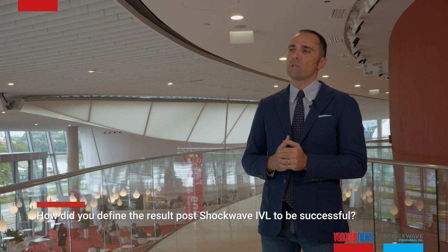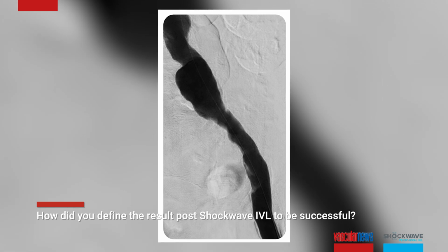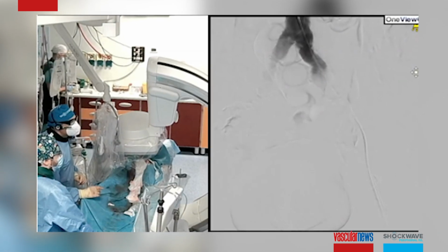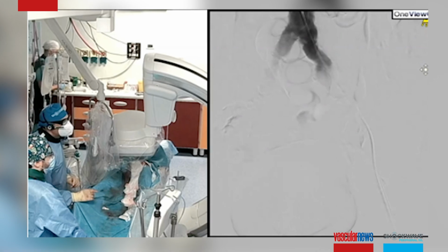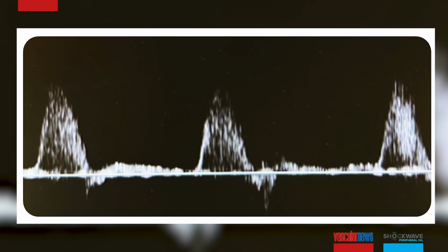Of course, as always, we do at least 2 angiograms with multiple projections, and we add the EVUS control and the pressure gradient. We had no pressure gradient at the end, and the EVUS control showed us a triphasic flow. That means not only a better luminal gain, but also a better compliance. And of course, this is thanks to the Shockwave IVL treatment.